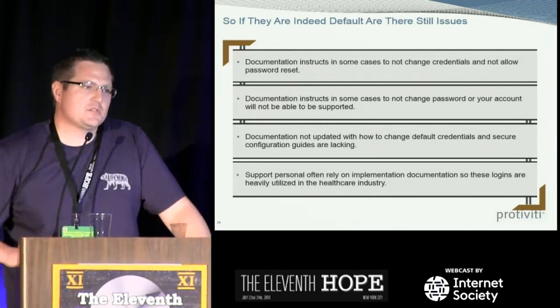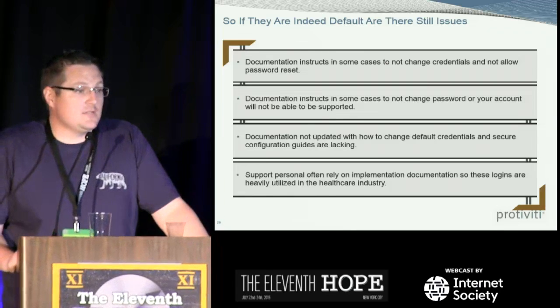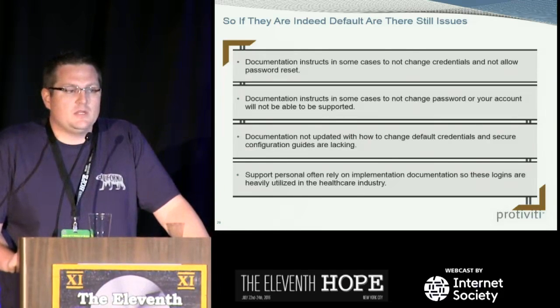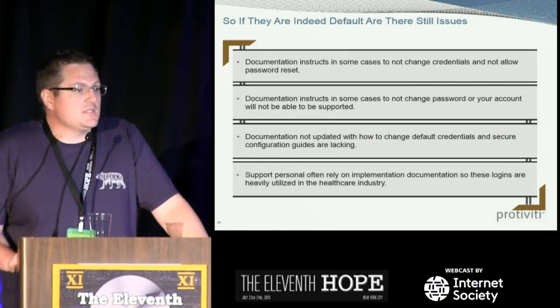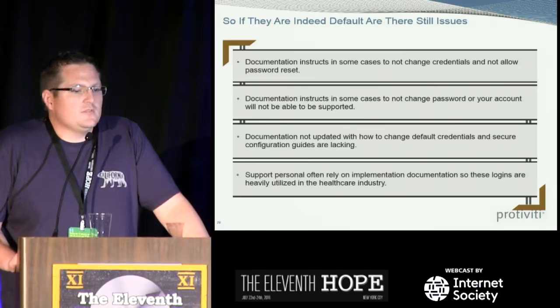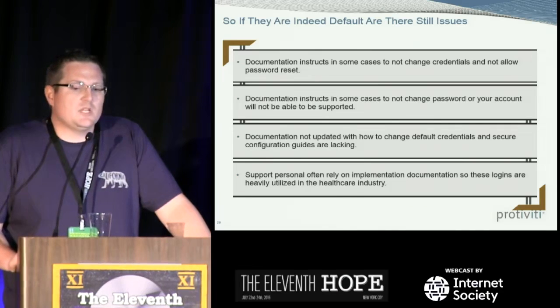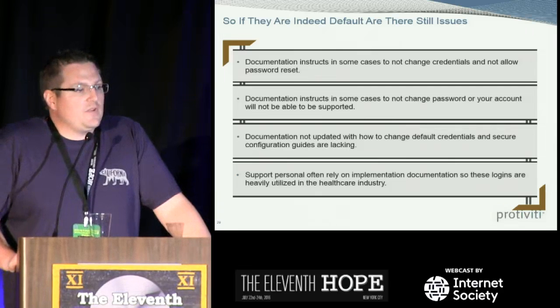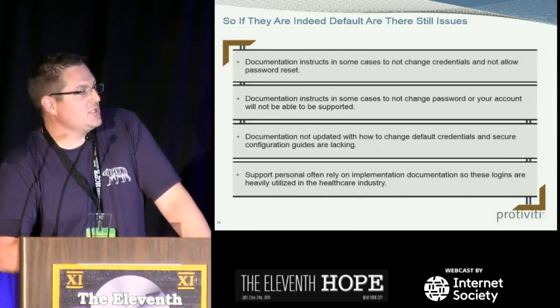So when we went through disclosure, some of the responses were, hey, a lot of these are default. In some cases they are default, and in some cases they do actually provide instructions in the manuals given to the installers or to the hospital systems that, hey, you should change this and this is how you should do it. But saying they're all default is contradictory, because I will show you some examples inside that specific documentation that would indicate otherwise. These are the installation guidance that either the manufacturer support staff or the hospital or a third party are using to install. So there are still indeed issues.